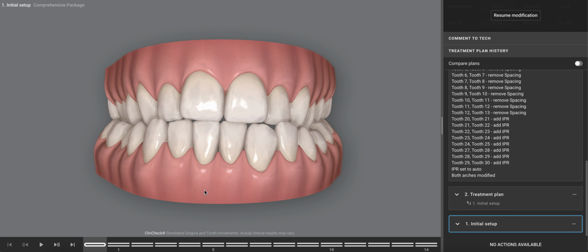With that said, the patient was very clear to you that she was not interested in orthognathic surgery, was not interested in even non-surgical approaches to expanding the palate, something that we do a fair amount of. Patient just wants to straighten her teeth.